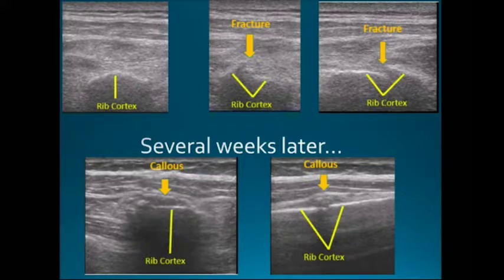But in a person who can talk to you in the clinic and say, it hurts here, well, you put it right there. I'm going to step away. If I approach you with the probe, that's something I've learned: I actually make them put the probe on, because if I put the probe on and cause them pain, they'll swing at me.